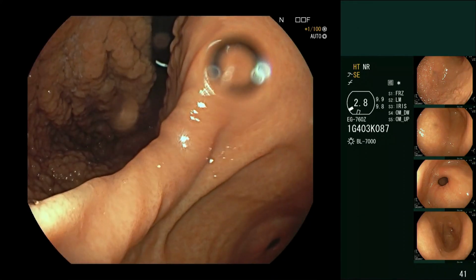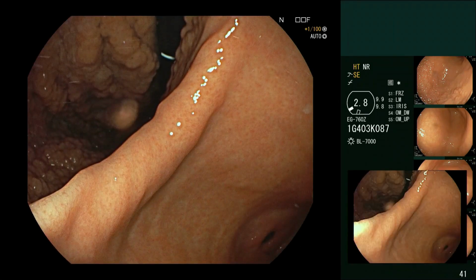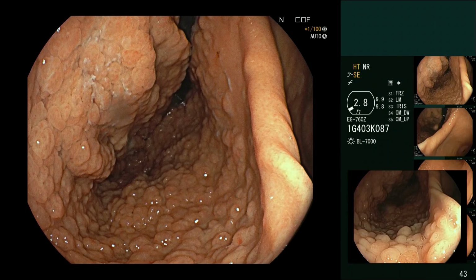And maybe you also want to, and now it's the next part, get a photograph of the angulus. The angulus is poorly imaged. You need this sort of view. You need to distend the stomach, okay? And so you want to get this sort of view of the angulus. That includes the pylorus, so you know where you're talking about, and also probably one that includes the other side as well, so that you can see everything.